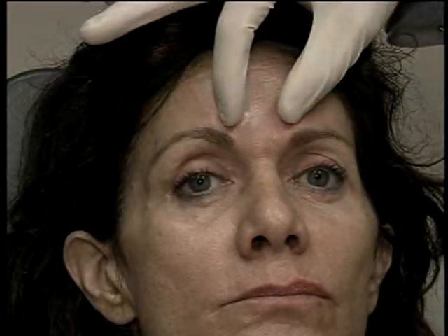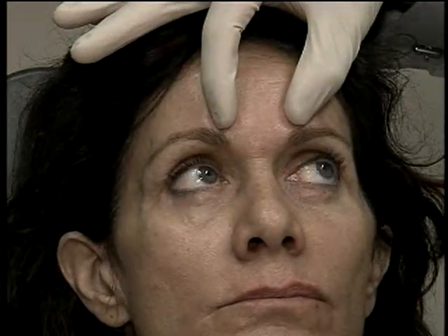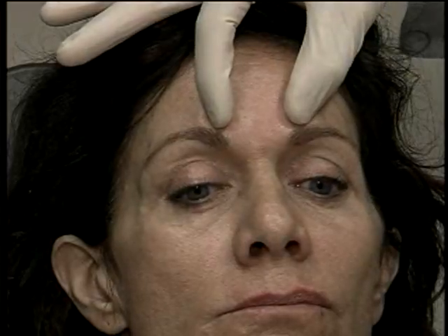So I'll have you frown your eyebrows, and you can see the glabellar area. That's an area that I will occasionally treat with fillers. I like to use it in combination with a neurotoxin. I think the combination works wonderfully, and in fact neurotoxins are my treatment of choice for this area, but occasionally if I cannot get rid of those lines, I will treat it in combination with the filler. One of the things you can do is you can spread the creases apart, and if you can't see them being eradicated by this maneuver, then filler is an option or indicated. For her, she could use maybe a little bit of filler, but she should get a nice result with botulinum toxin in that area also.